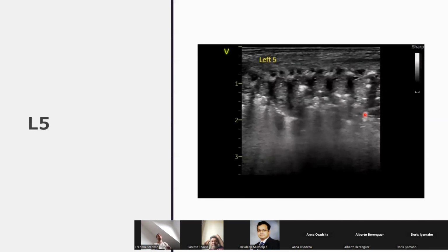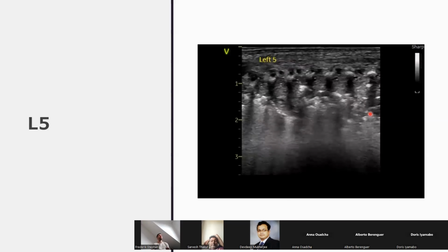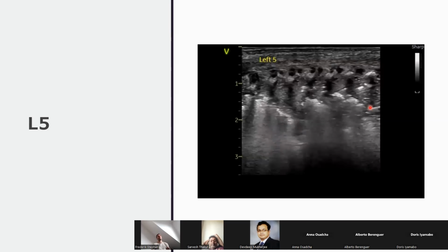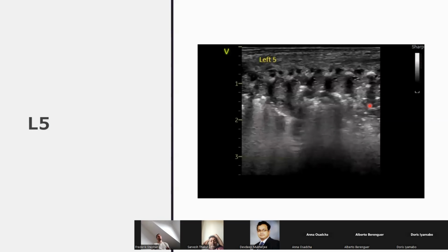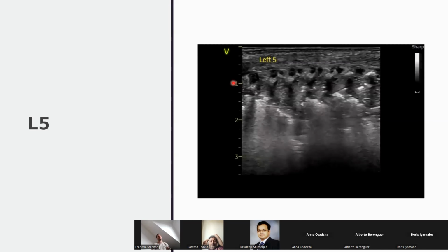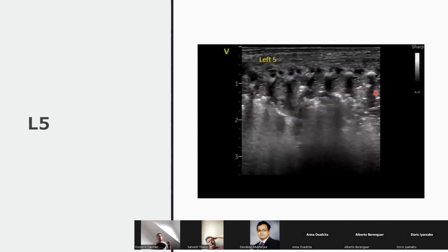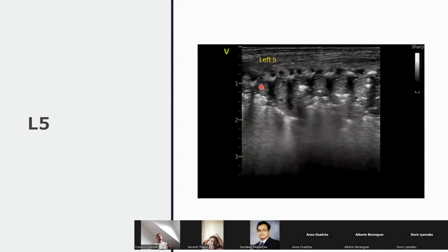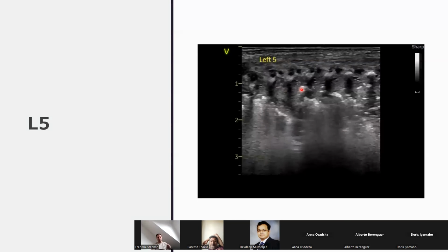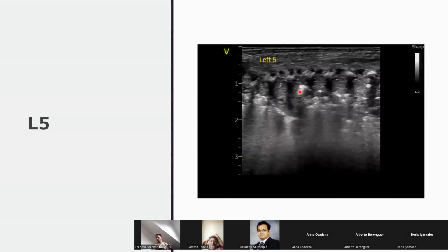No, I think as Satish said, the pleura appears to be, you can't see a pleural line. There's a lot of subpleural consolidation, or rather, you can say it's very shredded, like shred sign. Can we say that it's a C line, the top? Yeah, it's a C profile just below the pleura. I wouldn't say there's a shred sign there, Praveen.